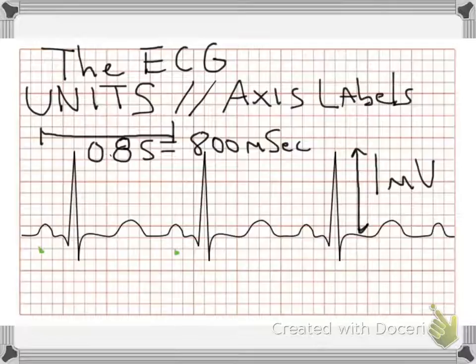What that means is this 120 millivolt change from minus 90, the depolarization, all the way to plus 30, really can be measured at the surface of the body, not in the heart, but at the surface of the body, and by then that signal decays, so it's only about a millivolt in magnitude.